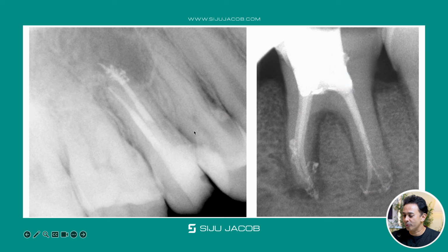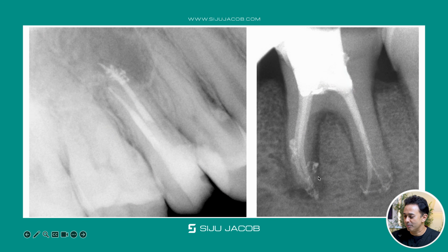Okay, let's get started. We know for a fact that canals aren't uniform tubular channels. They usually consist of multiple ramifications. Pulp tissue is not one straight tube like a gutta percha cone. You have multiple ramifications, and we sometimes discover this when we treat non-vital teeth and the sealer goes into these ramifications. You don't really find these sort of ramifications many times when you treat vital teeth, but non-vital teeth, we tend to discover these ramifications much more often than vital teeth.